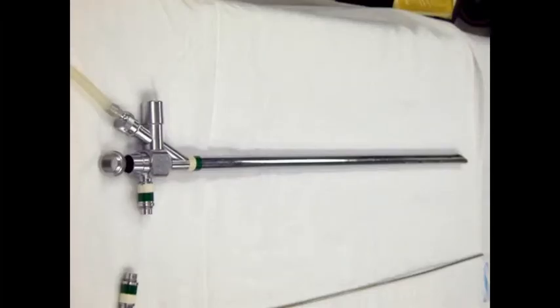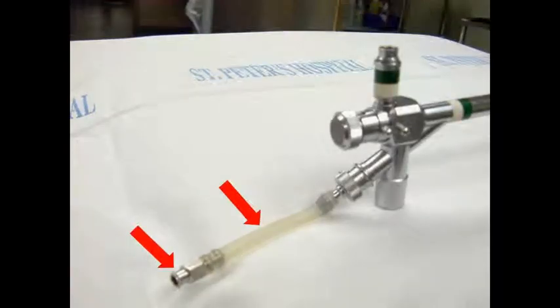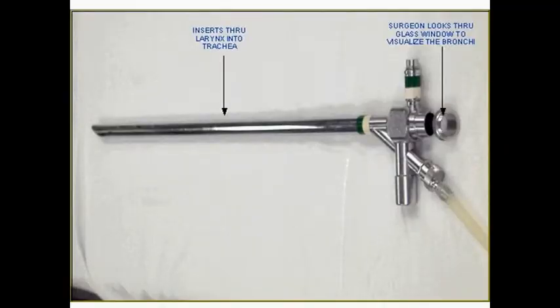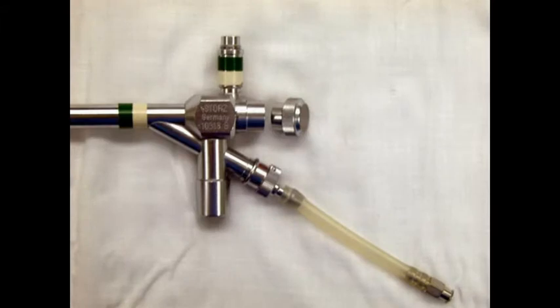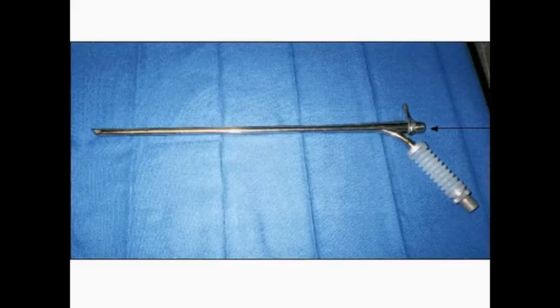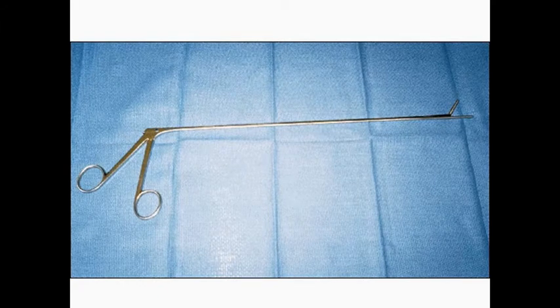Here is a selection of the surgical instruments that you may see in use during a typical case for laser resection of a tracheal stenosis. Note, of course, that different surgeons have different preferences, and so you must quickly develop a familiarity with the instruments that your surgeon will use. Note here the very long forceps for holding the mitomycin soaked pledget in position.